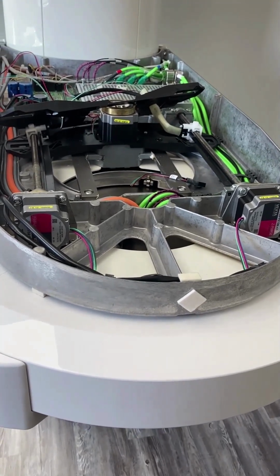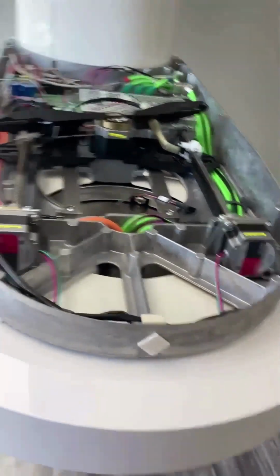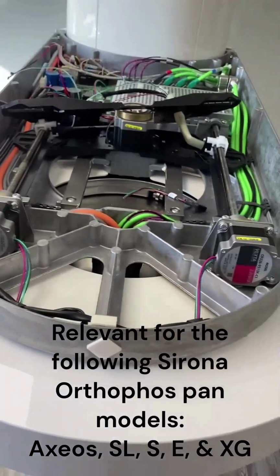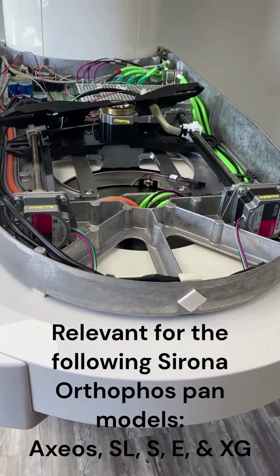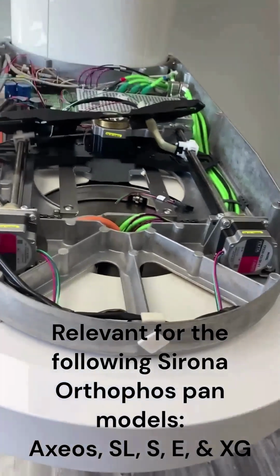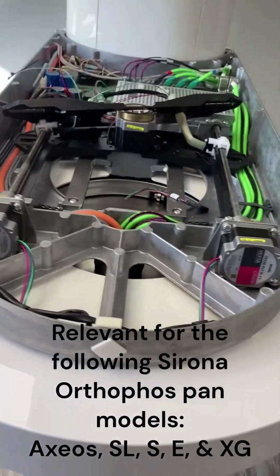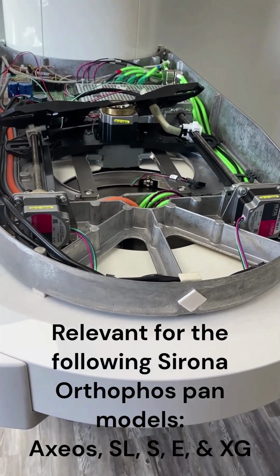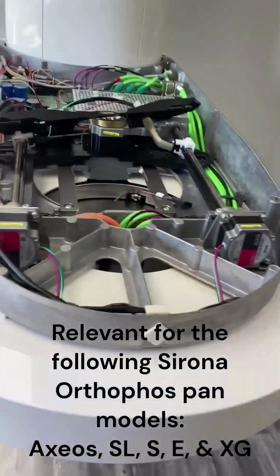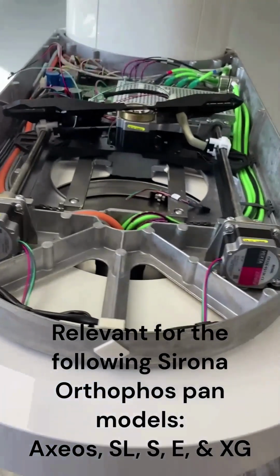We're going to wrap it up here with the third and final part of diagnosing and replacing a faulty light barrier in the Sirona Orthophos XG pan. Now, I want to point out something really quick. If you'll take a look at the still image that we've got up, we've got the butterfly clamp, we've got it apart, we've got it separated, upper from lower, so that we can get to this faulty light barrier and get it replaced. But what I want to show you guys is it's not necessary to remove the rotation motor to get this clamp apart just to replace that faulty light barrier.